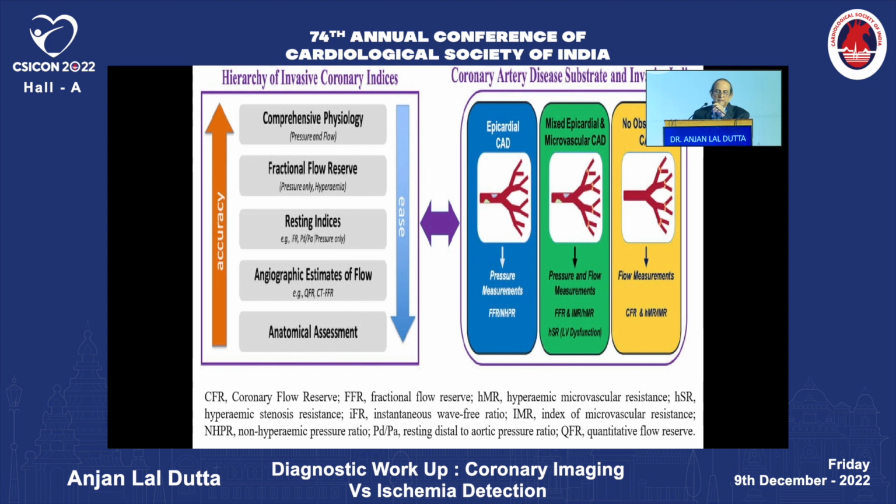If you find the pressure, coronary or systemic, there will be pressure and flow only. On the other hand, if we go for fractional flow reserve, we know that FFR can be obtained in the same procedure, and the importance of FFR, well known to us, is increasing further.